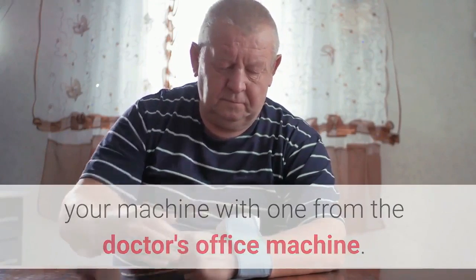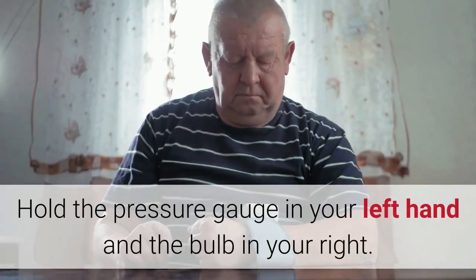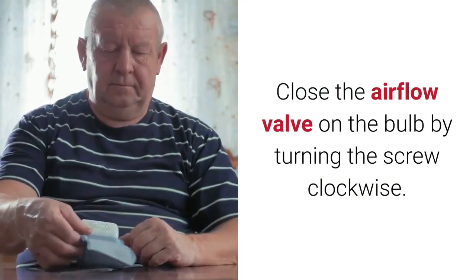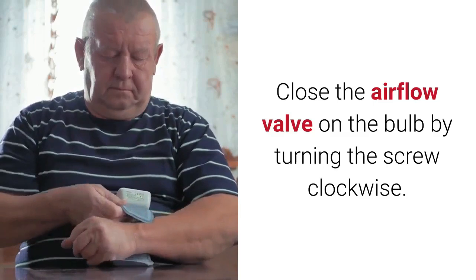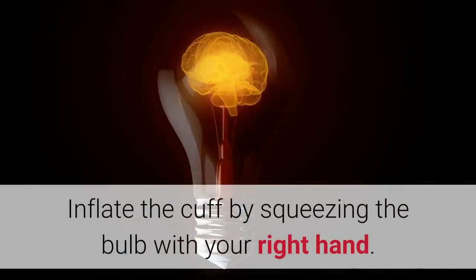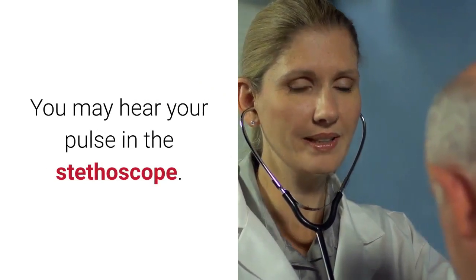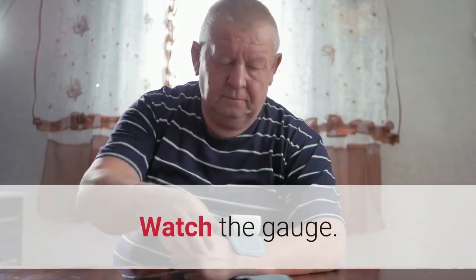Hold the pressure gauge in your left hand and the bulb in your right. Close the airflow valve on the bulb by turning the screw clockwise. Inflate the cuff by squeezing the bulb with your right hand. You may hear your pulse in the stethoscope — watch the gauge.